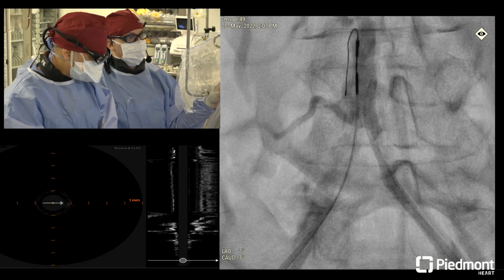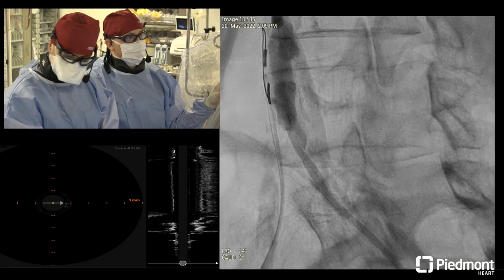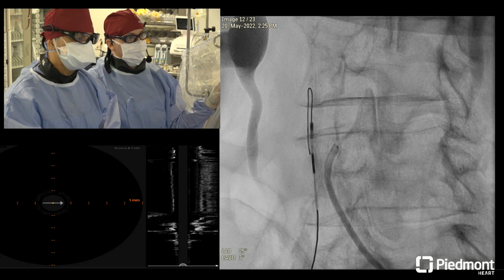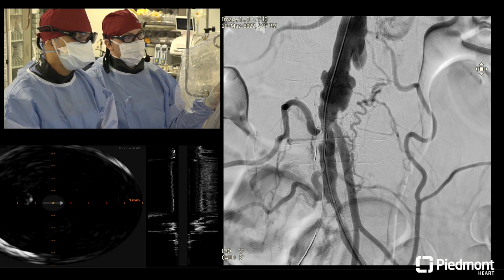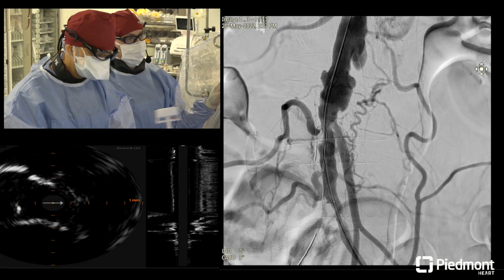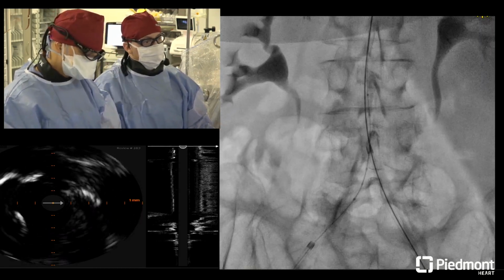So we've got through, we have a Grand Slam wire up now, and what we've done is we've just taken a shockwave balloon here now as our next strategy, because obviously there's a ton of calcium there. So that's our first treatment strategy here, which we're going to do with you live. Ready? Go ahead. Yep. So the idea here is I really want to be able to push all that.